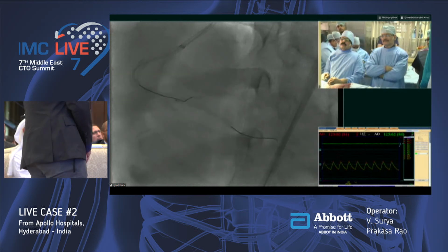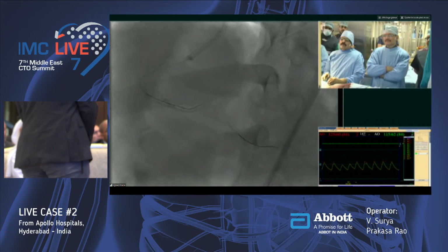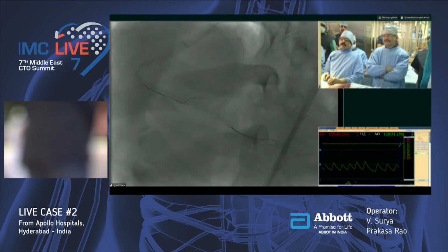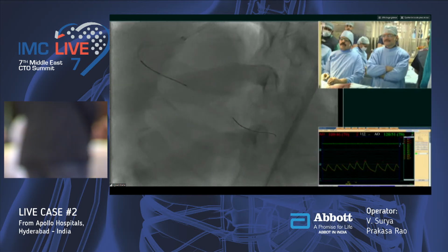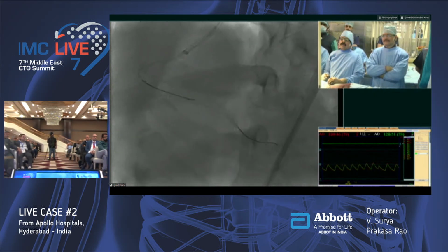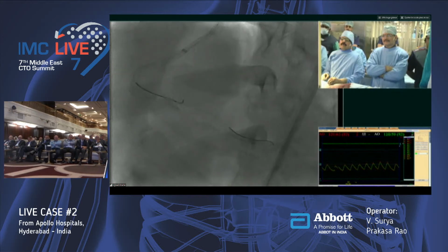And remember, my teacher always told me that you have to have plan A, plan B, prepare the case well. And this is where maybe we have not seen the distal properly before we started putting another stent, where we made our life now more complicated. But this is a good learning case because we learn from these cases. And this is why we are presenting this.